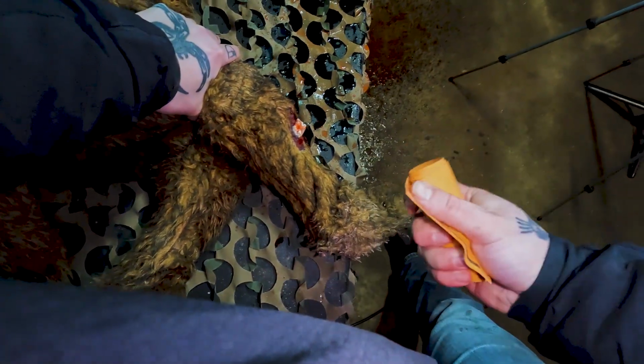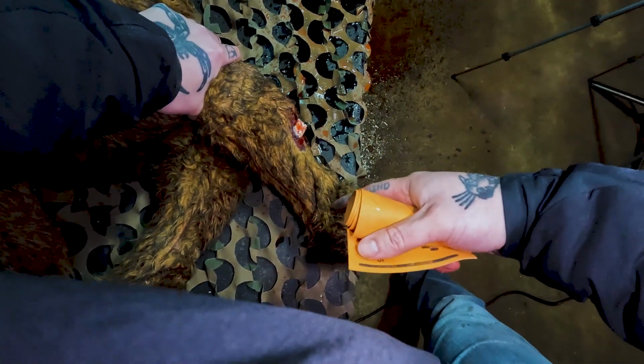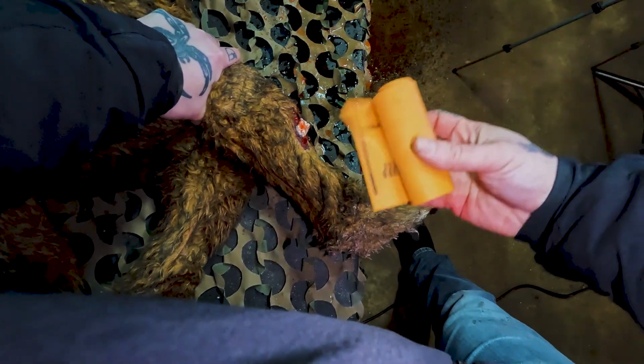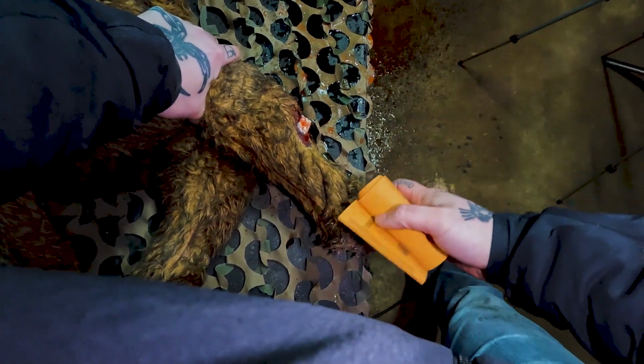It's always a lot easier to treat a canine casualty with more than just yourself. But at this point, it would probably be better to have someone take the SWAT tourniquet and place it above your hand. If you're by yourself, you may end up letting some more blood escape the body while you put the bandage on, but at least you've stopped it while you're getting your bandage or the SWAT-T ready.